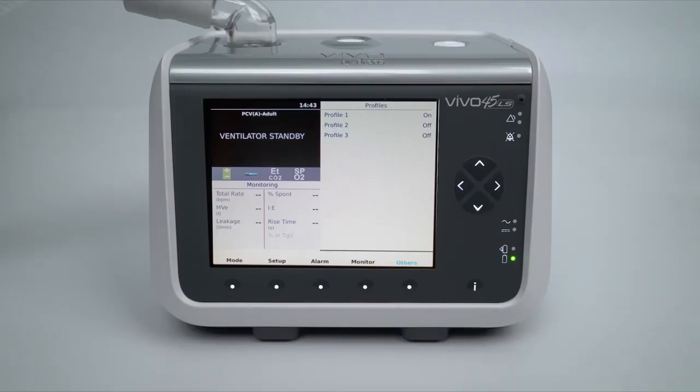This function can be used for quick selection for a patient or caregiver using different settings, for example, at night or during daytime. When we select the Home Adjust settings, then click the right navigation key, we are taken to the Home Adjust settings screen.